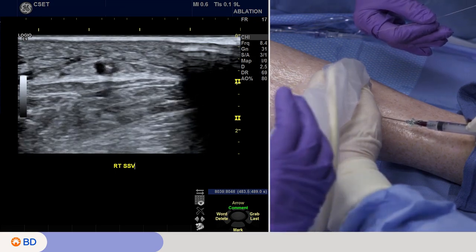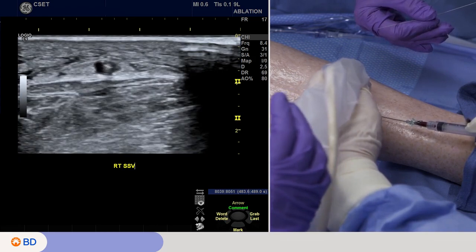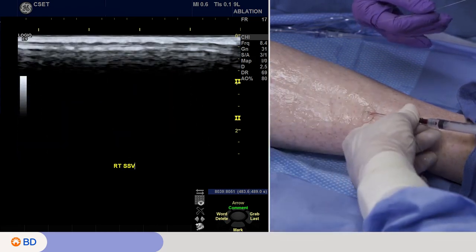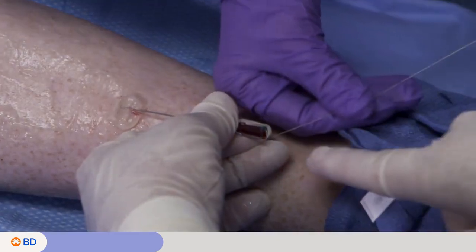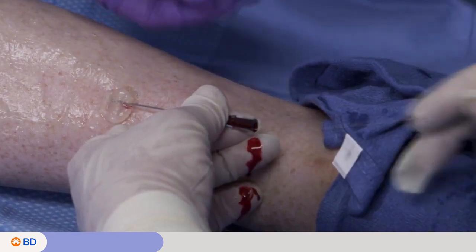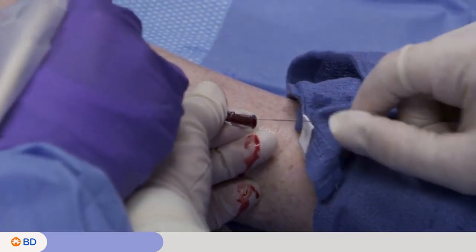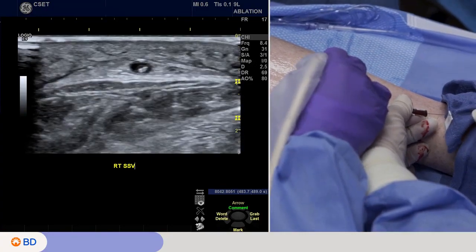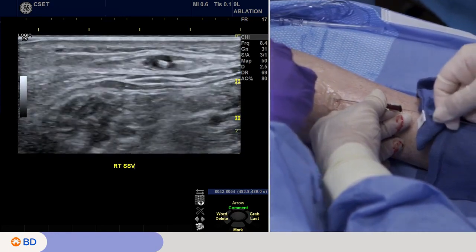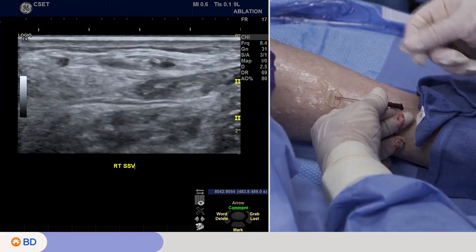That's an instructive point there. You can see on the ultrasound it looks perfect, but it actually was grabbing the front wall of the endothelium of the vein. I look to see if I have confirmation of venous return, and I do. Then bring in the wire, and look at it. This is a tactile and visual way of knowing if I'm in the center of the vein. You can see I'm advancing it. It feels very smooth. I have no resistance.